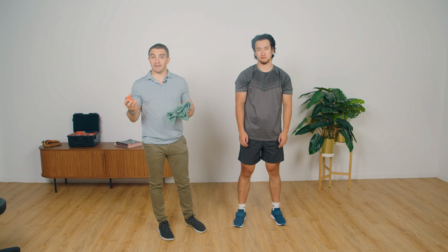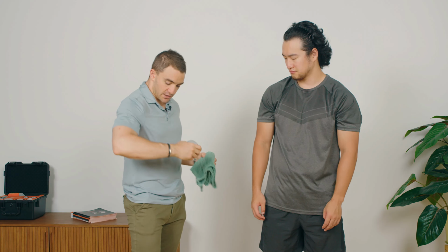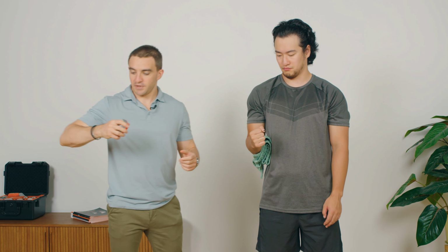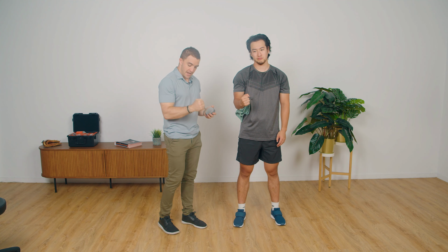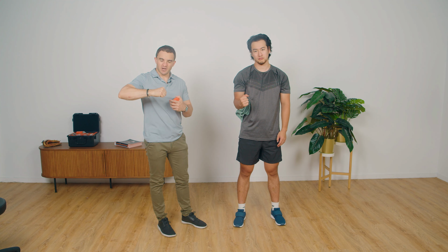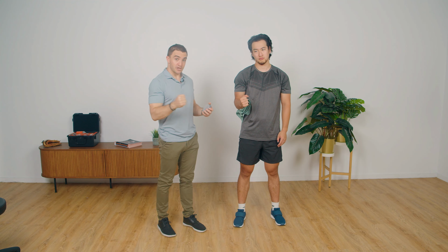First, we're going to discuss a make test, and that's using a handheld dynamometer. So Cal, go ahead and tuck the towel in. The reason we tuck the towel in is because we want to fix the humerus to the patient's body. Often the compensation we see as someone tries to externally rotate is that their elbow will flare out, and that gives a contribution from the deltoid in abduction.